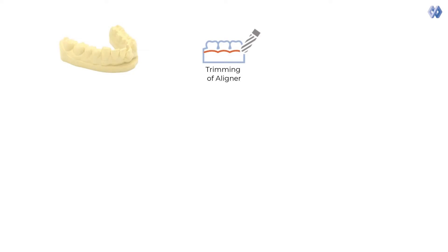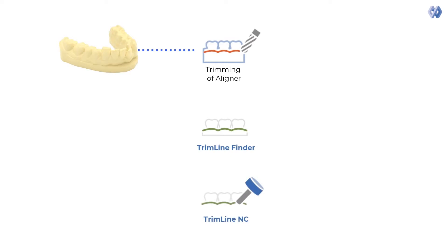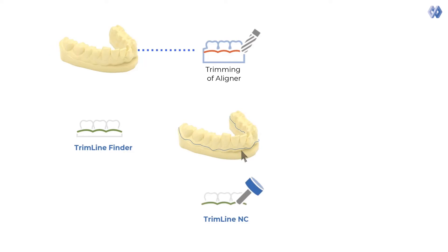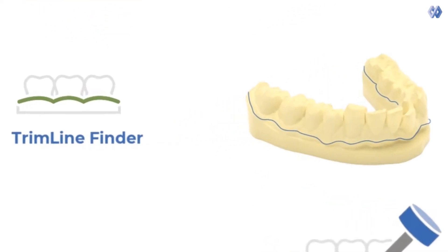ModuleWorks Digital Dentistry provides a complete solution to fully automate clear aligner trimming. ModuleWorks Trimline Finder eliminates manual labor by automatically deciding where the best trim line should appear. This means the lines must no longer be manually drawn, saving precious minutes in the process of each patient order.